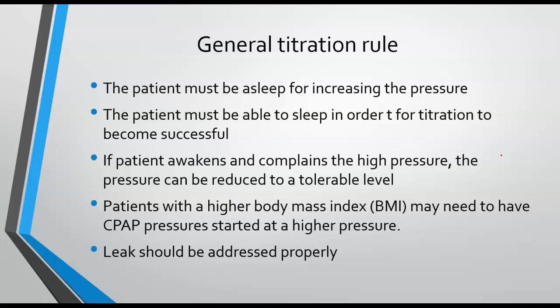A patient with a higher body mass index may need to have CPAP started at a higher pressure. And another thing is that the leak should be addressed appropriately.